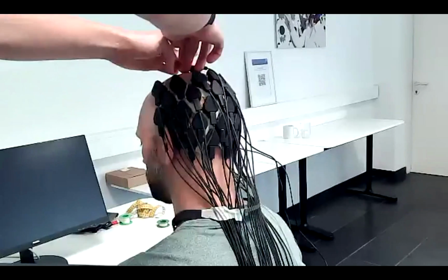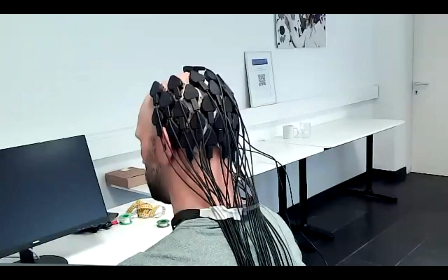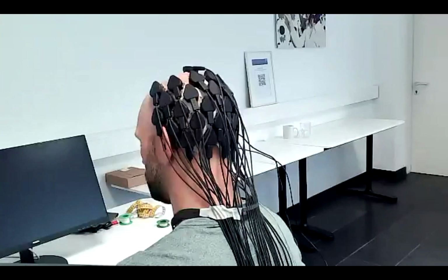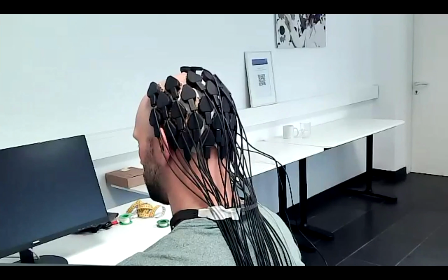So I'm just tapping on all of the sensor locations, and then I can make sure they have good contact. But therefore, it's important that you have a channel detection for bad channels, that you can then also remove from further processing and from your common average reference. But this little tapping on the electrodes is actually good enough to reduce the impedance, because we have this very sticky electrode gel for the pangolin. And when you just press it a little bit, it gets in solid contact with the skin. And over time, it even gets less because it goes more into the skin.